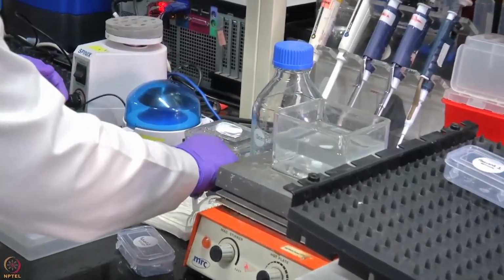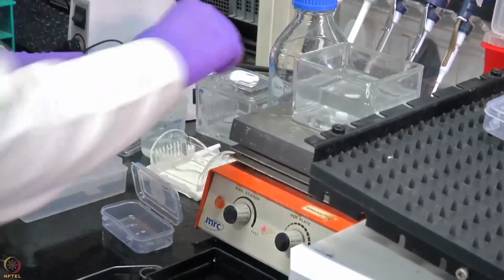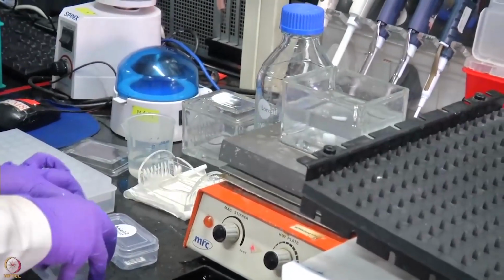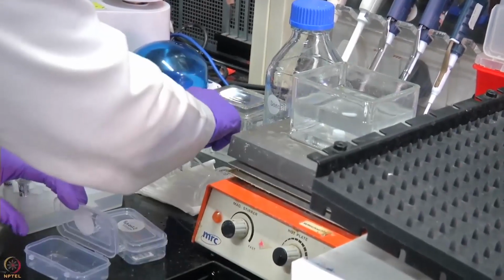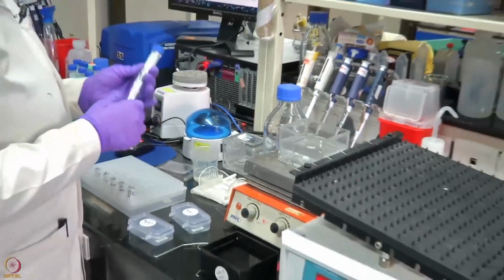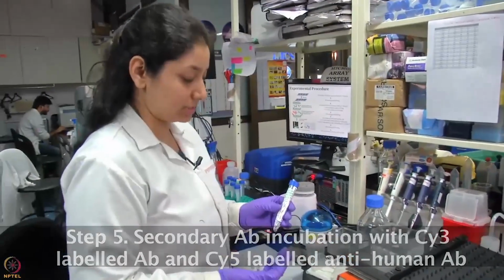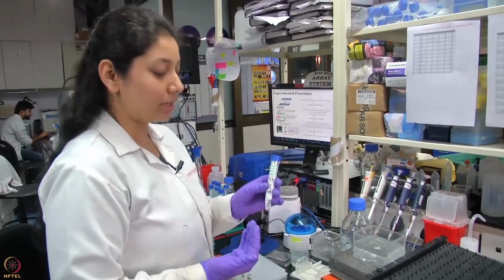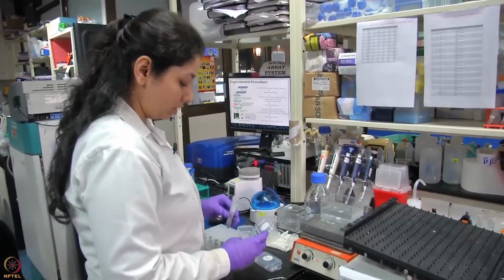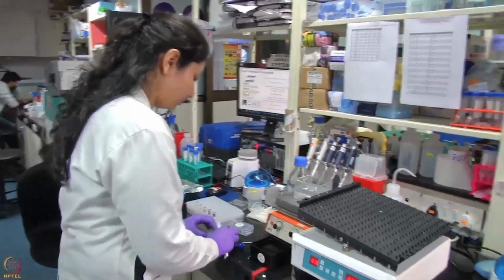The slide, once dried, is then again placed in the box for the secondary antibody incubation. So the secondary antibody mixture is a light sensitive reaction, and it contains Cy3 antibody, which is anti-rabbit, that is against anti-GST antibody, and Cy5 labeled anti-human antibody. So here we will put the solution onto the strip. So now we will do the same thing for the second patient sample.